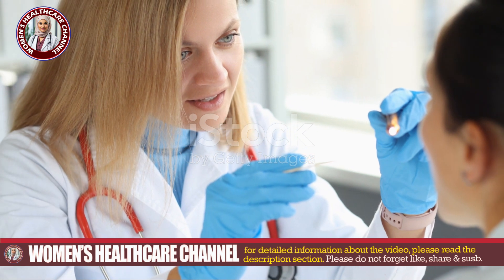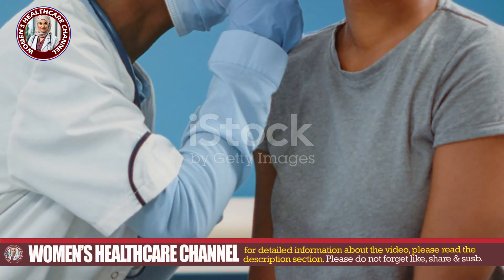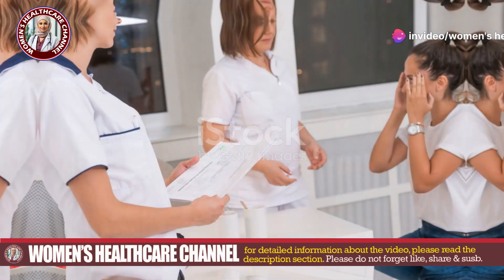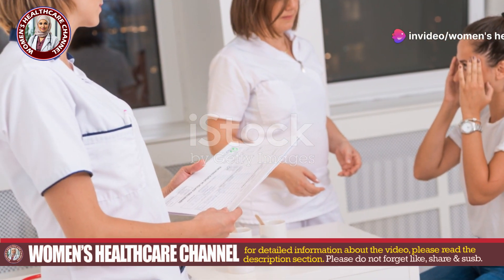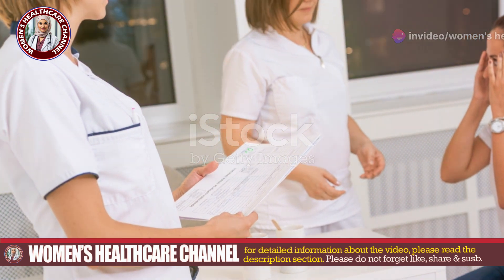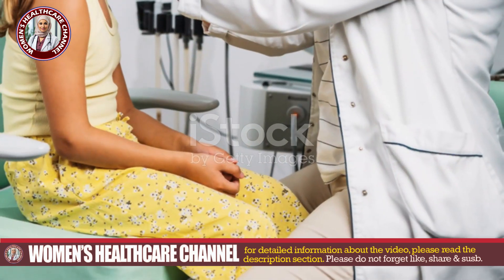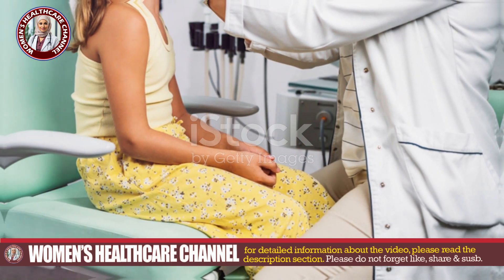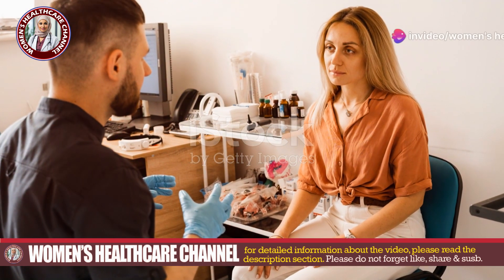Remember, prompt removal is essential to prevent complications like secondary bacterial infections or damage to the ear canal and tympanic membrane. Seek professional assistance if the infestation is severe. Educate the patient on keeping the ear clean and dry, and the importance of completing the prescribed antibiotic course.